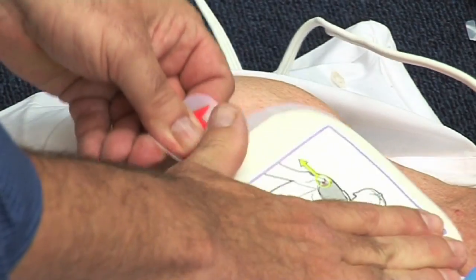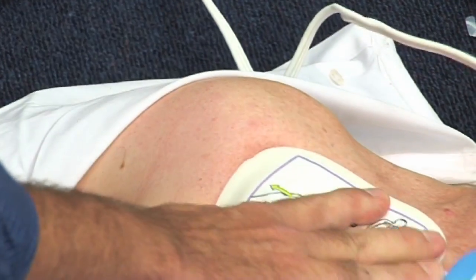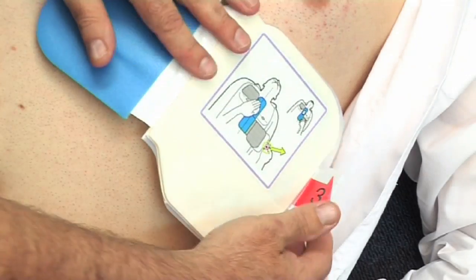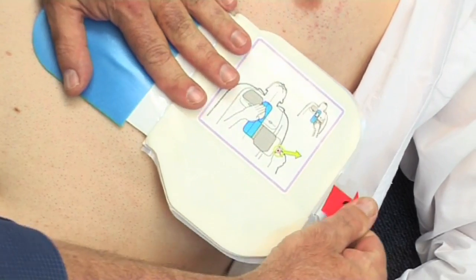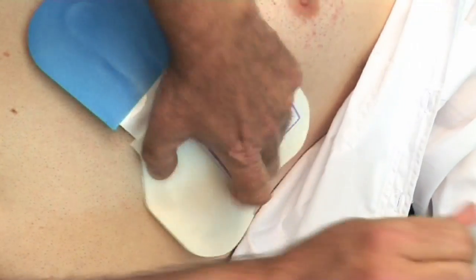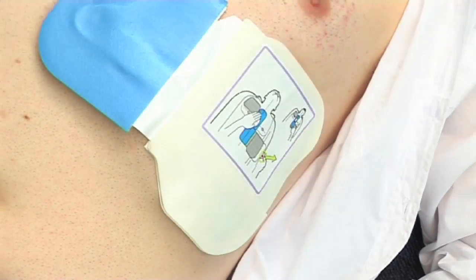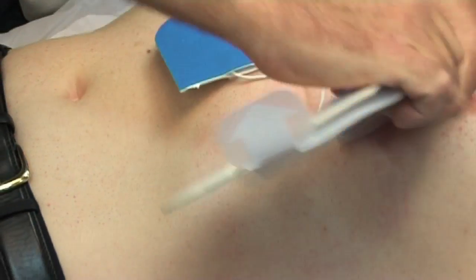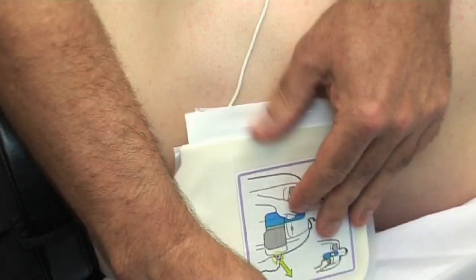Remove the backing tab from behind the electrode pad labelled 2. Press firmly from the centre out to make sure it adheres properly to the patient's skin. Do the same for electrode pad labelled 3. If the patient is large or there is a need to place the pad under a breast, you may need to tear away the lower pad at the perforated line.